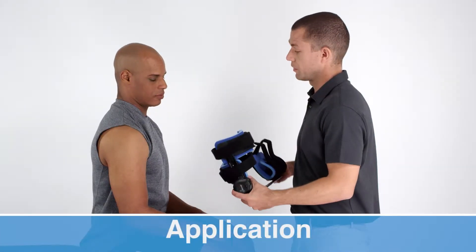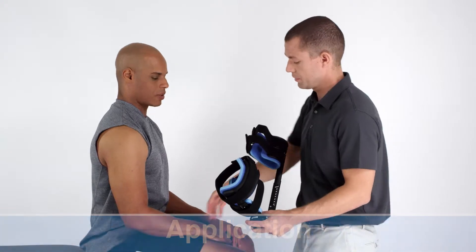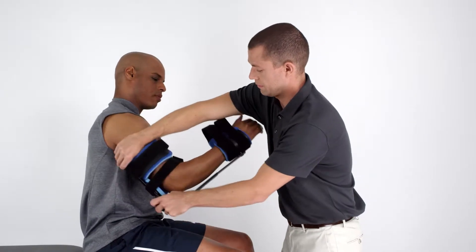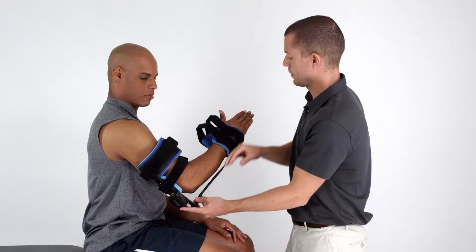With the device locked, you may apply the orthosis to the patient's arm. With the strut running along the forearm and the tension spring positioned behind the elbow, slide the hand, thumb up, through the molded cuffs.